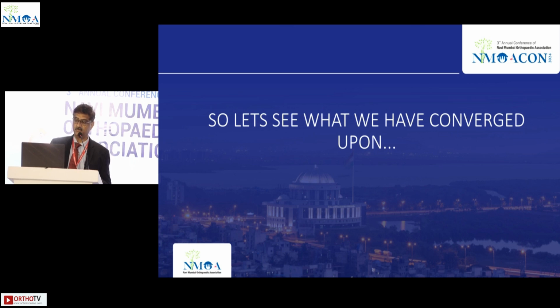So let's see what we have converged upon. What are we using nowadays? If you ask me, if the patient doesn't have a budget and there is an economical constraint, I would always go for metal on poly. If the patient has good economical support, then we can think of going for a ceramic on poly design and an uncemented one. Thank you.